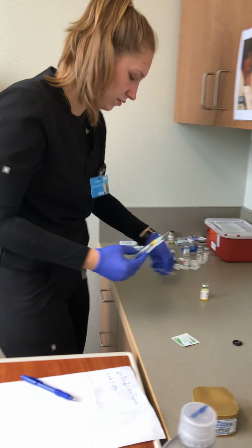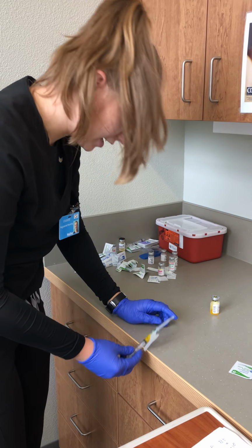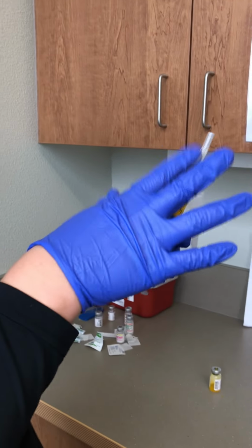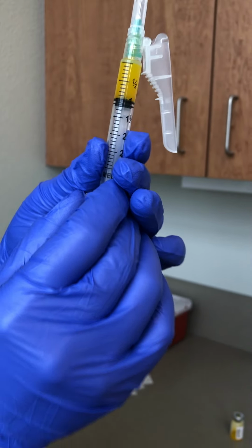Pull that out. I'm going to go ahead and recap this. And like I said, I would have in reality kept my filter needle on, drawn this up, and now I would have switched it to this needle. I did that, and I have 1 milliliter.